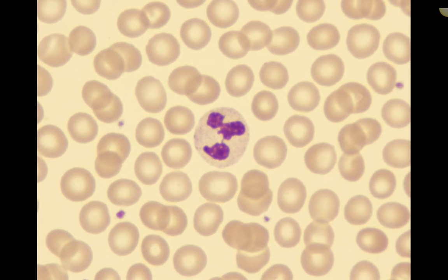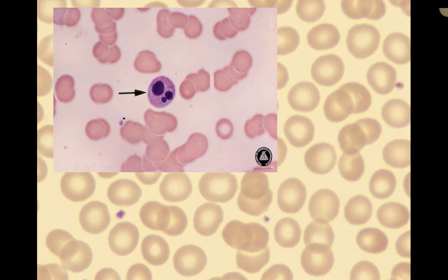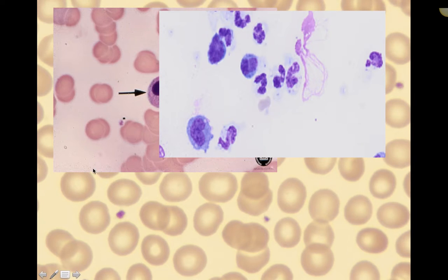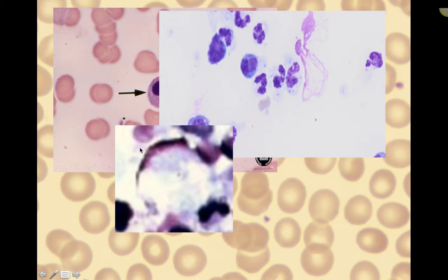Assessing the age and number of neutrophils indicates the body's response to infection. Here's a neutrophil — it looks almost hypersegmented but is not terribly abnormal from regular peripheral blood. This is also a neutrophil undergoing various stages of degeneration, and this one is undergoing severe degeneration — so much so that its entire nucleus has shifted to one side.